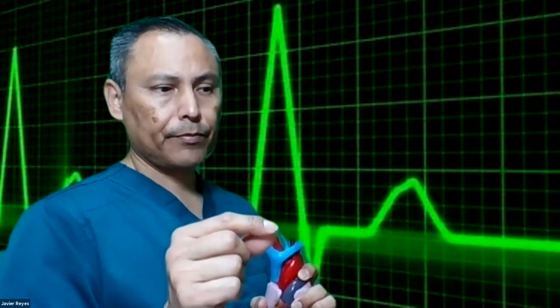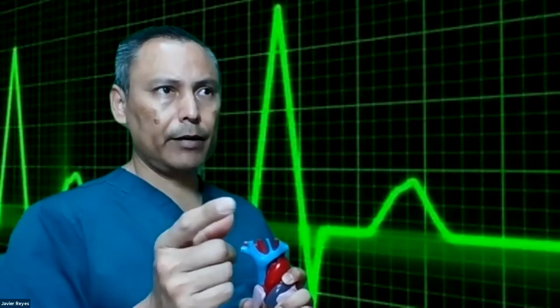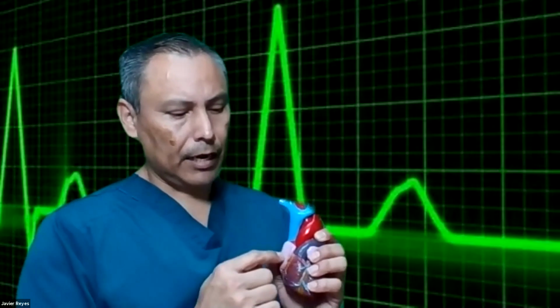So write down: PR interval greater than 0.20 equals first degree AV block. You can abbreviate PR interval as PRI, whatever, greater than 0.20 equals first degree AV block. And that's it. And it's going to be constant. The PR interval is going to be, let's say it's 0.24, 0.24, 0.24. It's all going to be the same. Something is happening in here that is blocking the impulse from the SA to the AV.